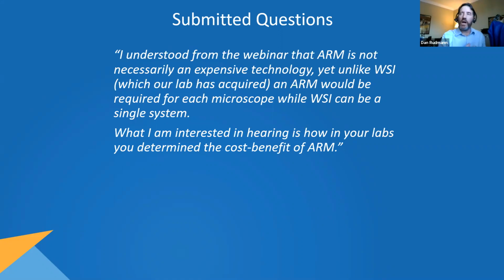So the other thing about WSI AI is, you're going to have a bunch of trainers, pathologists working with computer scientists to make these AI algorithms using WSI. And then you're going to be giving these tools to pathologists that weren't involved. Well, when you're using the microscope and using ARM, you feel like you're involved, right? A little bit more. And so there's a little bit more interaction for the pathologist, not only using their scope, but also in terms of tweaking how they need to use the AI to help them.